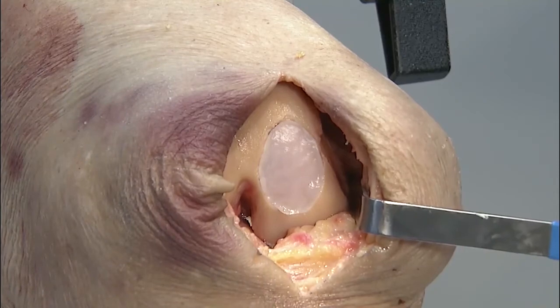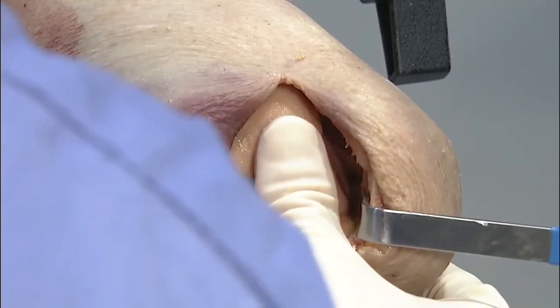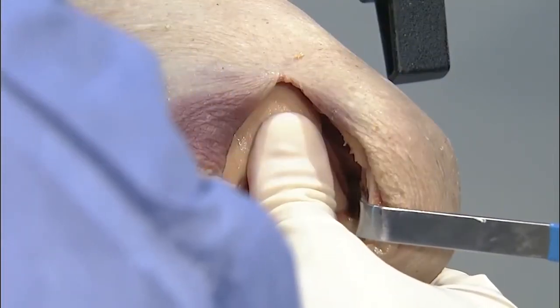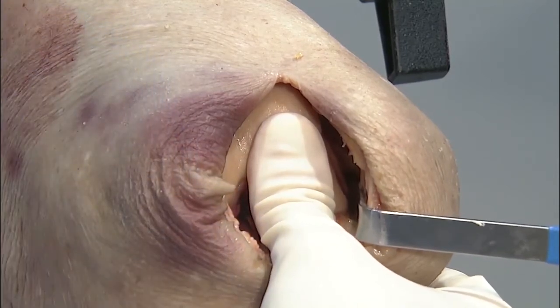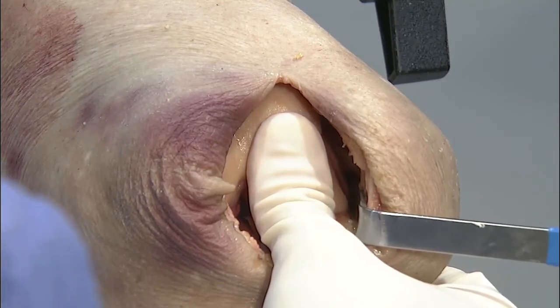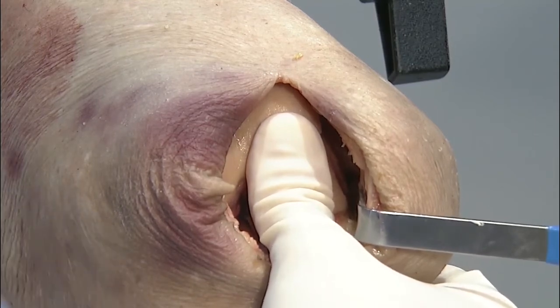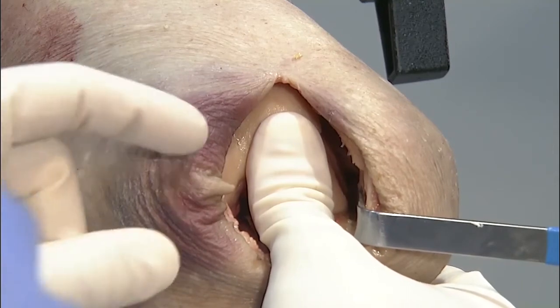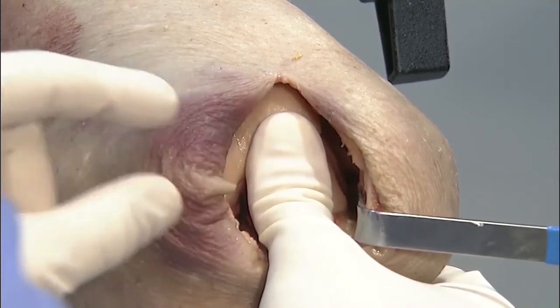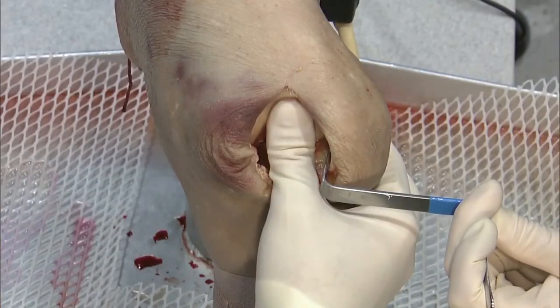Okay. So then you have to hold pressure for 3 minutes. What I do is I just put a little saline on the back of my thumb. You're supposed to put a 3-minute timer, and this is definitely the longest 3 minutes of your life, no doubt. But shorter than the 20 minutes of suturing. Yeah, 20 minutes plus. But again, you can see we're over on the lateral side here, but you could certainly use just a mini arthrotomy. It adheres very nicely.